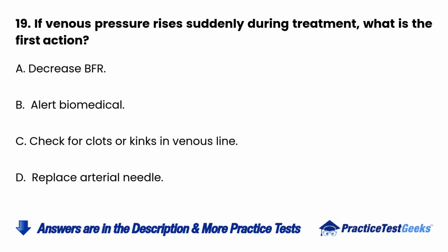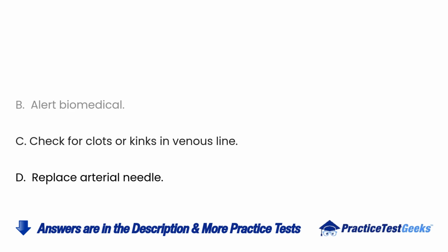19. If venous pressure rises suddenly during treatment, what is the first action? A. Decrease BFR. B. Alert biomedical. C. Check for clots or kinks in venous line. D. Replace arterial needle.